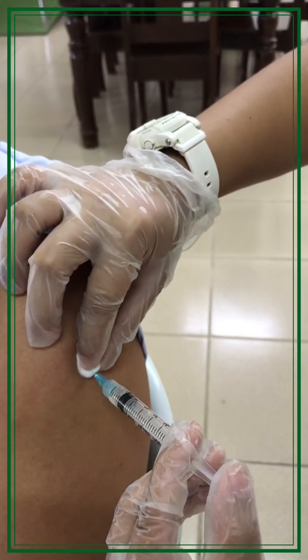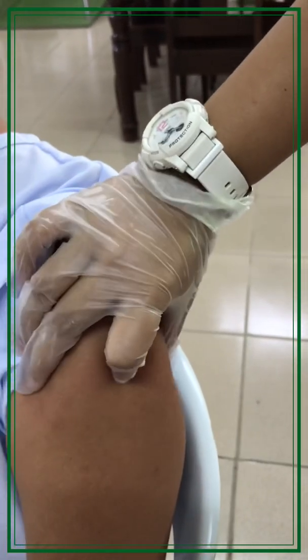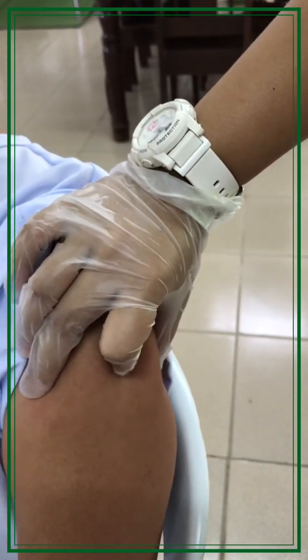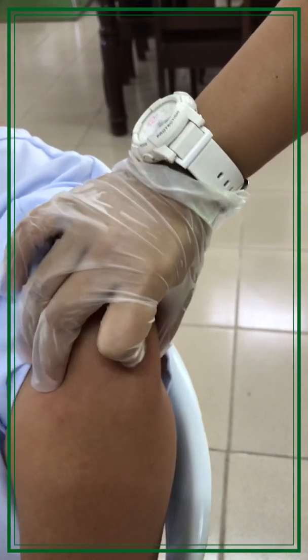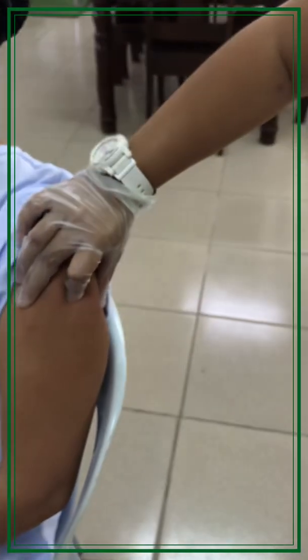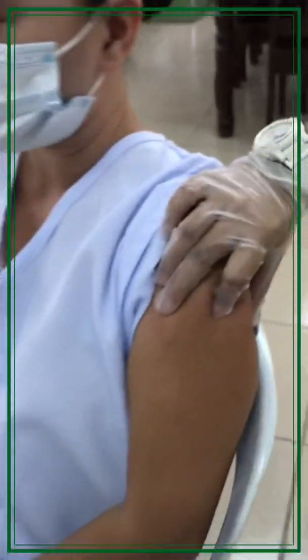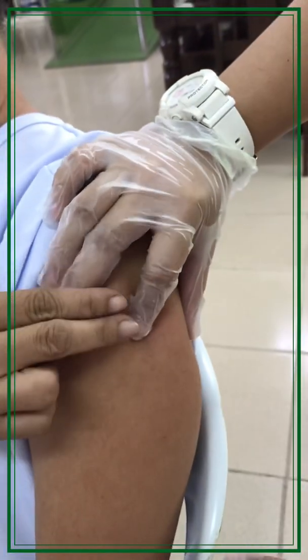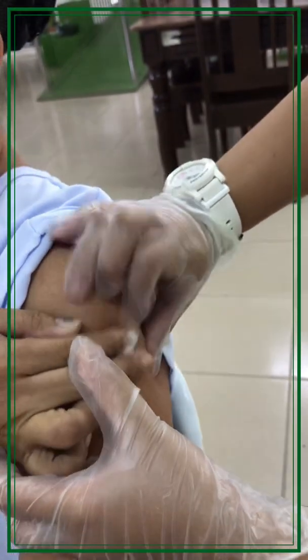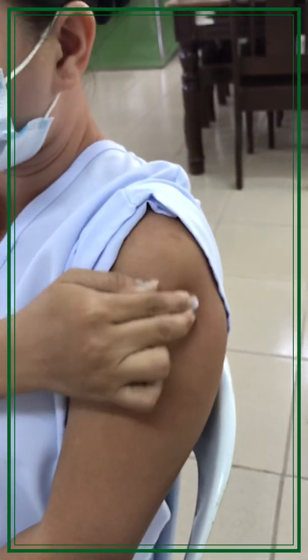Withdraw the needle while applying pressure with the prepared cotton. While applying pressure, you can recap the needle to avoid any accidents. You can also instruct the patient to apply pressure by themselves if the patient is able.